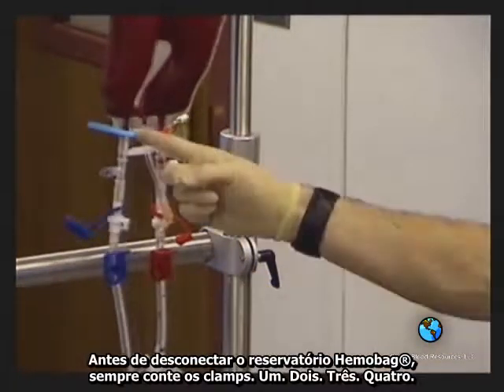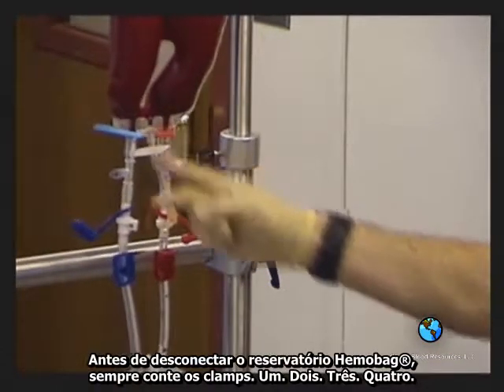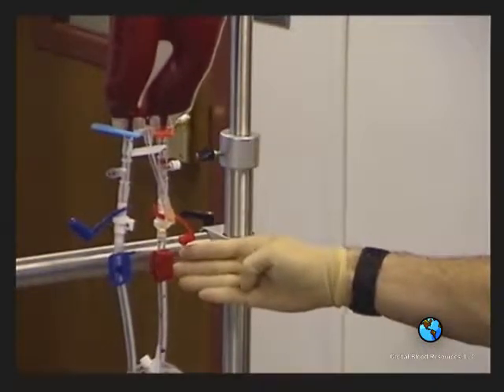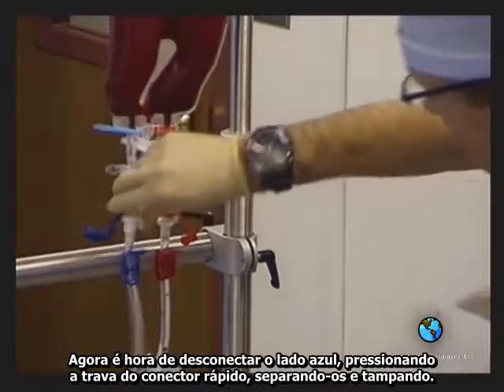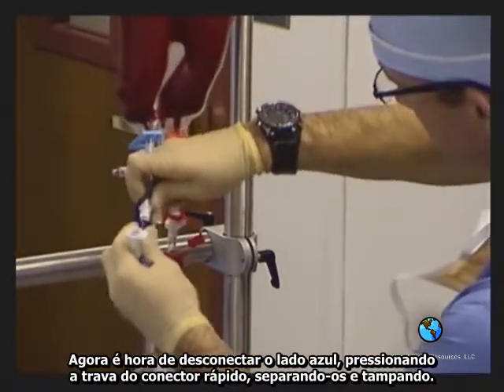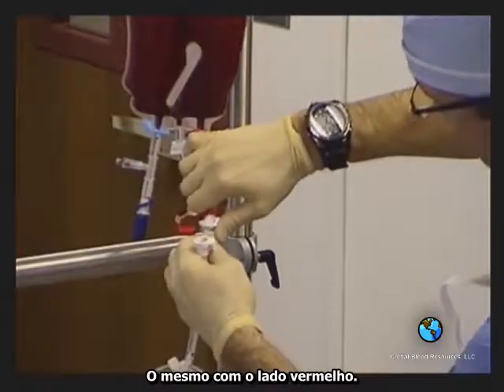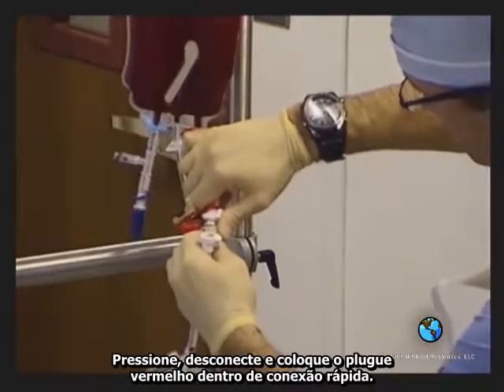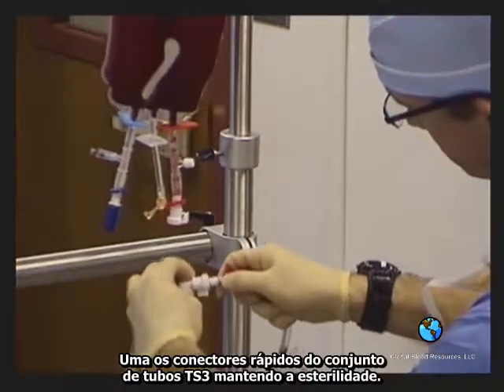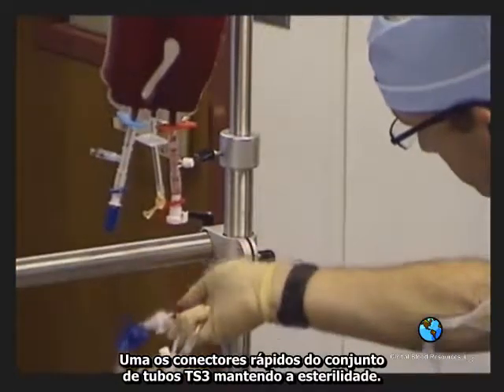Before disconnecting, always count out the clamps. 1, 2, 3, 4. Now it's time to disconnect the blue side by pressing the quick connector button and pulling them apart and covering. Same with the red side. Press and pull apart and place the plug into the quick connector. Then sterilely reconnect the TS3 tubing set together.